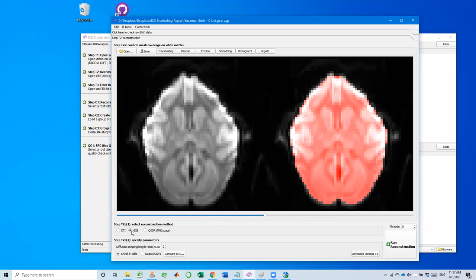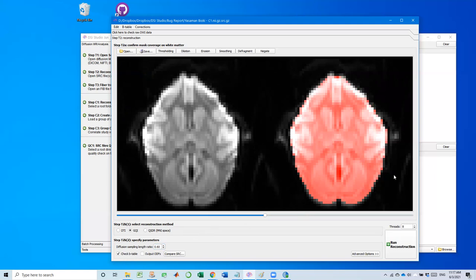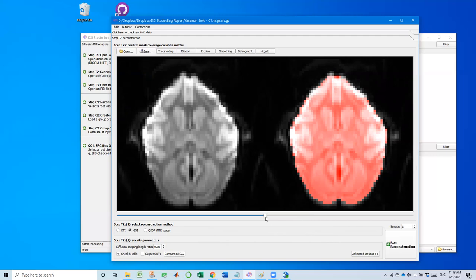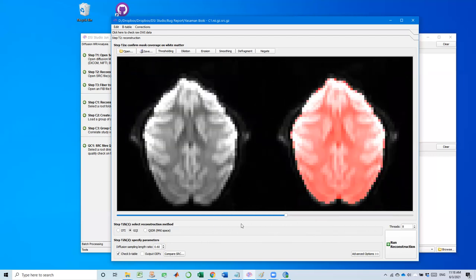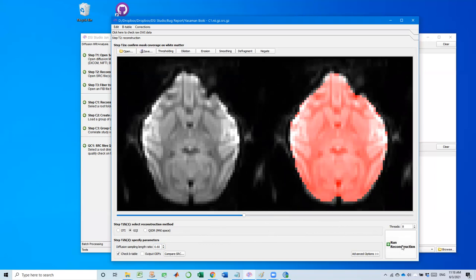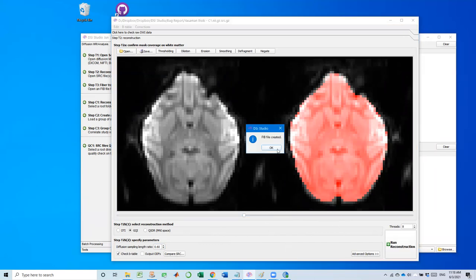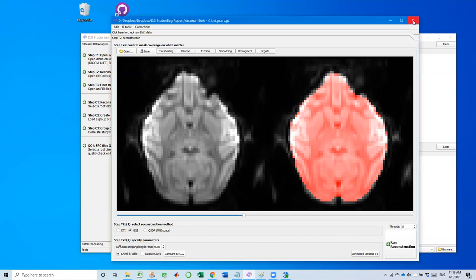So right now we have good mask, image orientation good. I will select GQI with default parameters. So for animal brain, I will always check B-table. The reason is I would say most of the time the B-table orientation may not be at the right orientation. It may be also flipped in some direction. This check B-table would allow DSI Studio to say this has to check all kind of combination and make sure that the one we come up with a good orientation that has good fiber continuity, coherence. So it's kind of automatic way to check the B-table. So since everything is good, we just click run reconstruction. Okay, that's it. FIB file created. So let's check the FIB file.